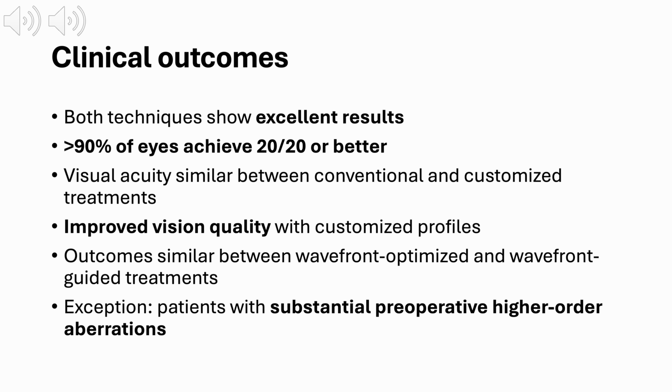In that subgroup, Wavefront-guided ablation can offer a meaningful advantage because it actively targets aberrations that Wavefront-optimized treatments are designed only to minimize, not correct. So clinically, the takeaway is this. Most patients do very well with either approach, but the choice becomes more important when visual quality, and not just acuity, is the primary concern, or when significant higher-order aberrations are present preoperatively.